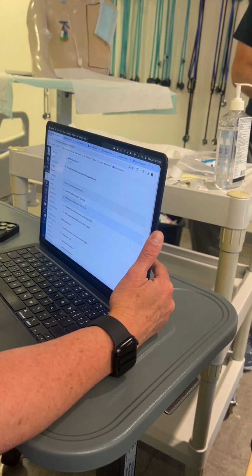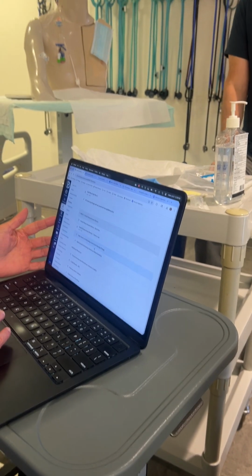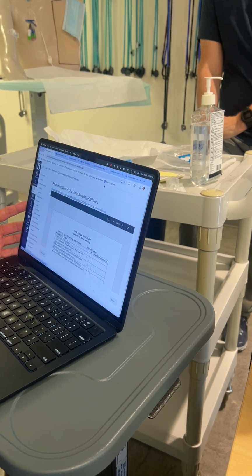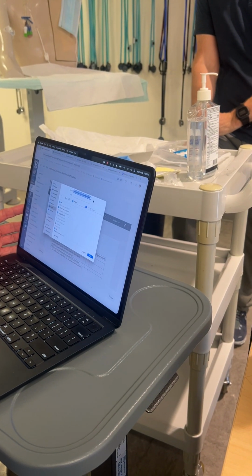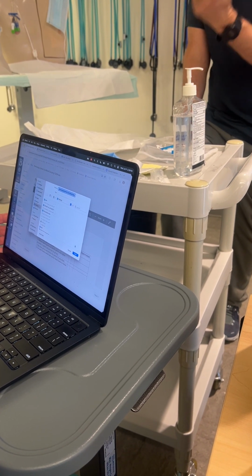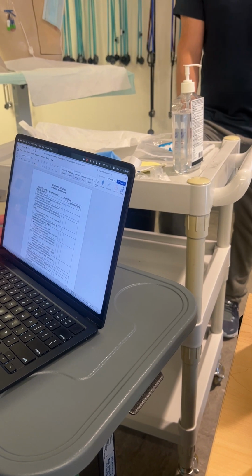But, so now I've got to do, I'm still in the room, right? Verify my patient. It turns out I need to draw a CBC and a CMP. So what color tubes do I need for bonus points? Lavender, green or gold for the CMP, right? Green or gold, and a lavender. So it's important to know your lab tubes.